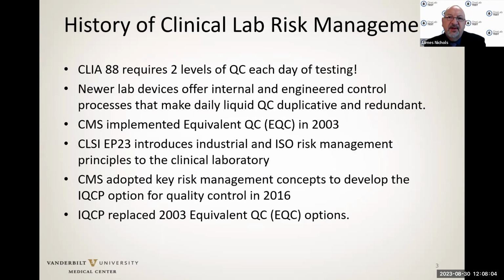Let's start with the history of clinical laboratory risk management. CLIA 88, when it was published, requires 2 levels of quality control each day of testing, or if it's a qualitative test, a positive and a negative quality control. Newer laboratory devices, however, offer internal and engineered control processes that make daily liquid QC duplicative and redundant.